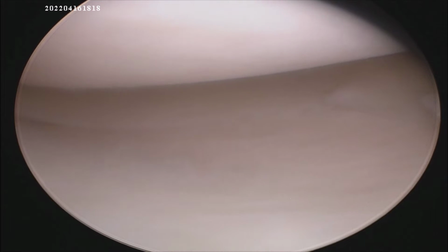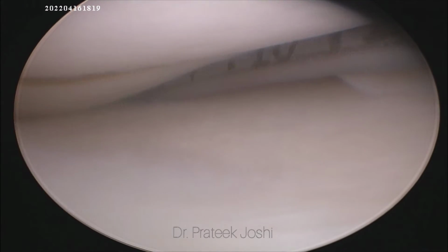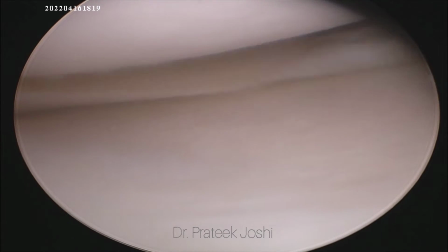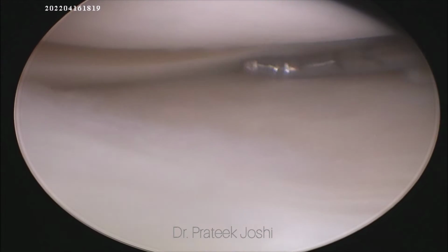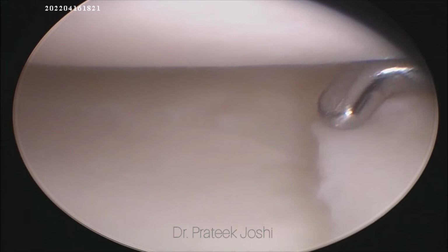On diagnostic arthroscopy, we can make out that there is longitudinal tear involving the posterior horn of the medial meniscus under surface, and this tear is extending to the body and exiting centrally as a radial tear. So since it's a combination of longitudinal tear with radial tear, we call it as a complex tear.